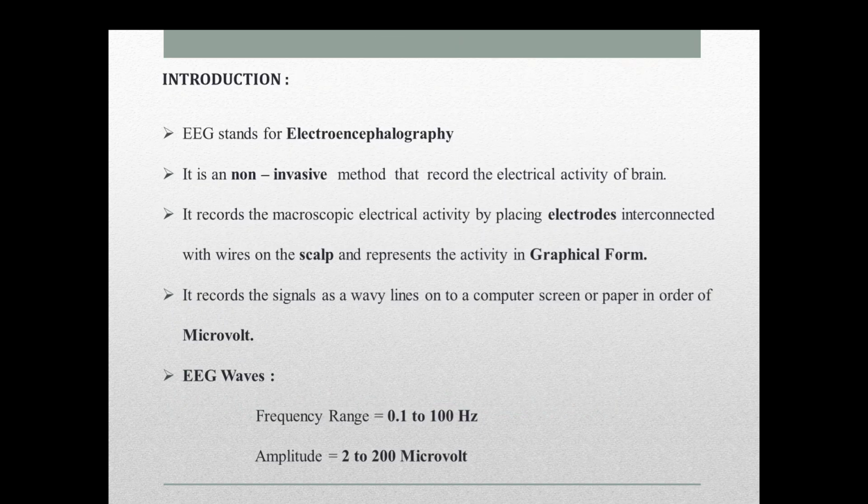EEG stands for electroencephalography. Encephalo means the brain. It represents the electrical activity of the brain. The "graphy" in the term refers to the graphical form, so the electrical activity of the brain will be represented in graphical form.